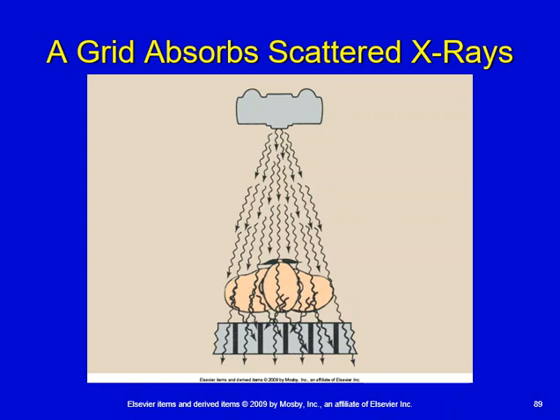In the last recording, I talked about control of the creation of scatter radiation. So now we're going to talk about the control of scatter after it's created. And that's primarily with a grid. You do have post-patient collimation, but primarily what we use is a grid.